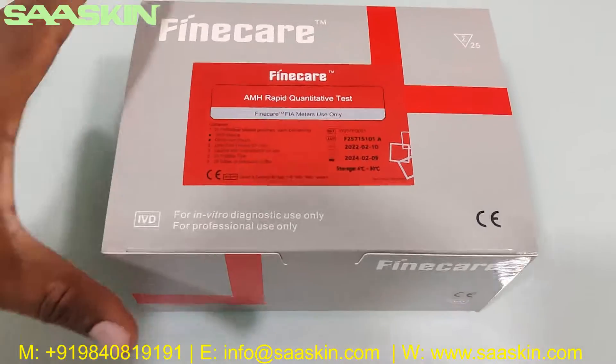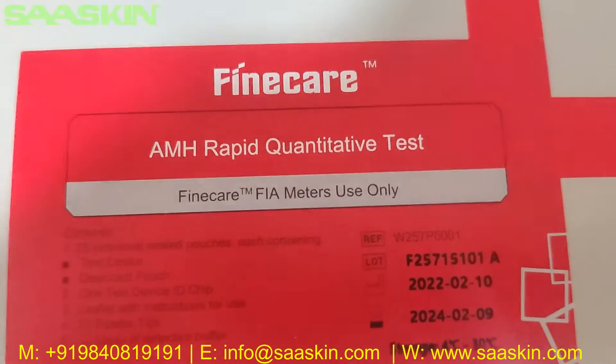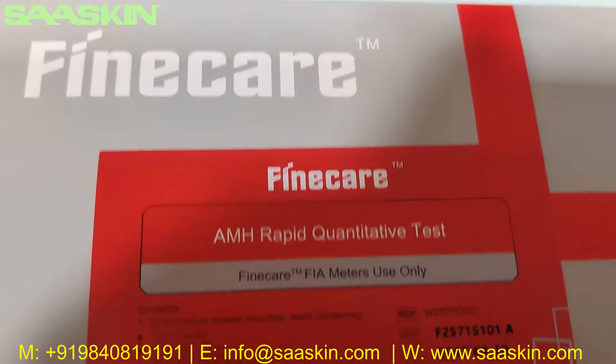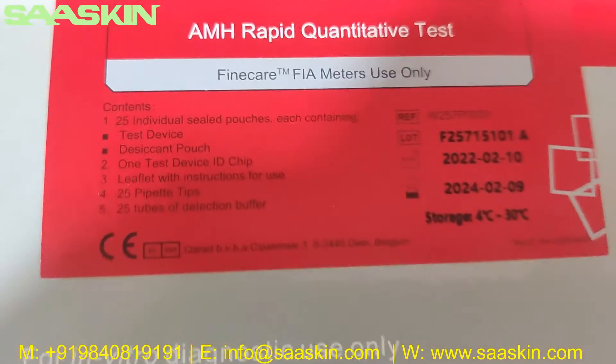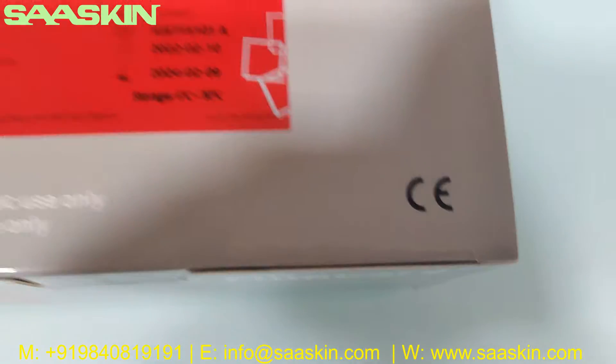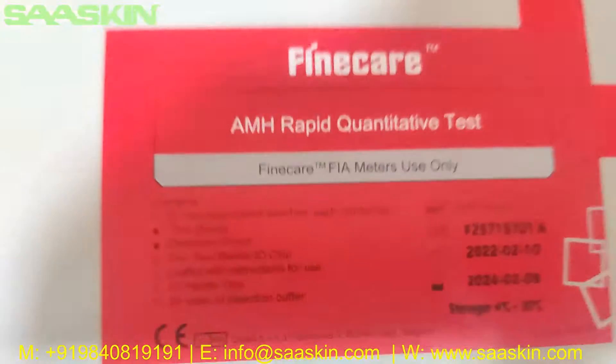Hello everybody, today we're going to see the unboxing of the Finecare AMH Rapid Quantitative Test. This is the Finecare AMH Rapid Quantitative Test, to be used with Fine Care fluorescence meters only. It's a 25-test kit pack, and it's CE certified. You can see the contents are shown here.